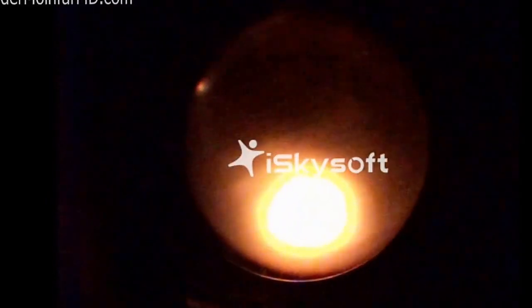And what I'm doing now is that scleral depressor exam part, and you may see at about 12 o'clock kind of a bulge. That's the peripheral retina coming into view. I'm going to try to redirect the light pipe towards that area. And I'm basically kind of walking around the eye. I was at 1 o'clock, now I'm going down to 4 o'clock. And then I'll just kind of rotate all the way around to make sure that I haven't created any breaks or tears or detachment during the surgery.